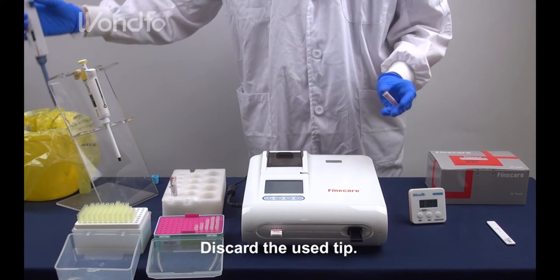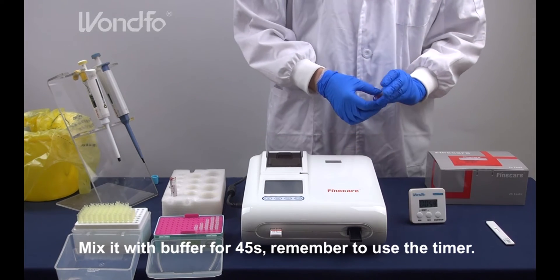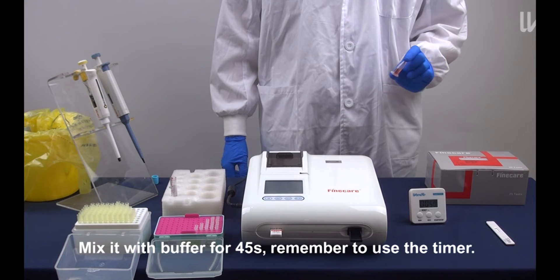Discard the used tip. Mix it with buffer for 45 seconds. Remember to use the timer.